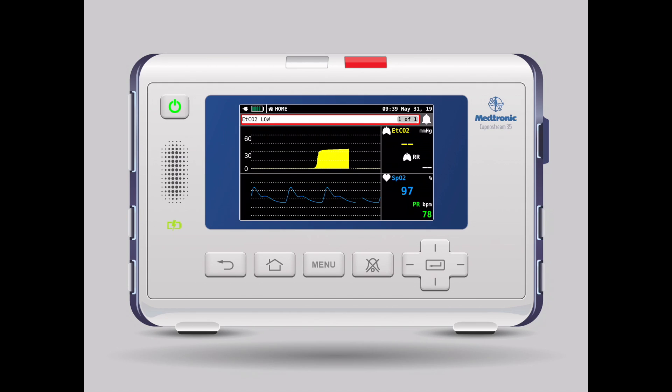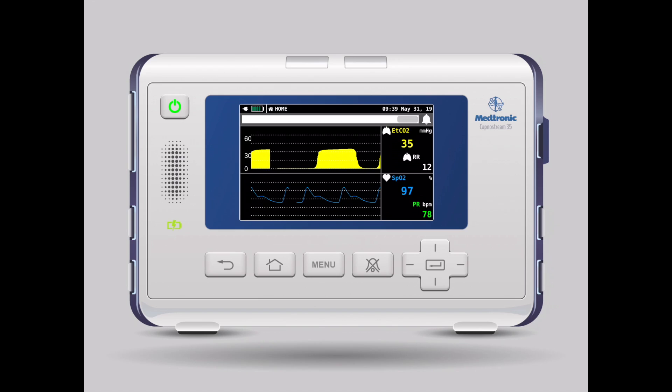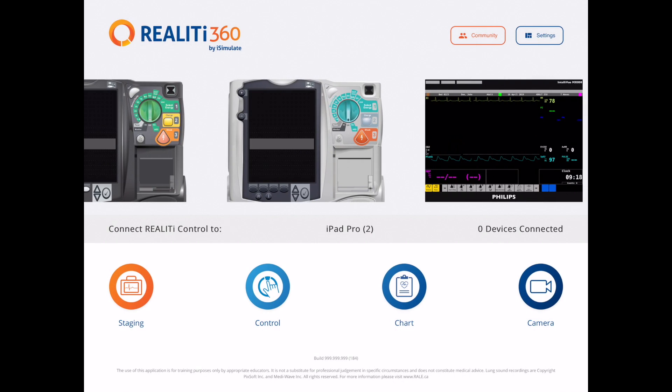So there you have it — there are all the new screens available on Reality 360, and some more videos will show you some of the new features that we have in it as well.